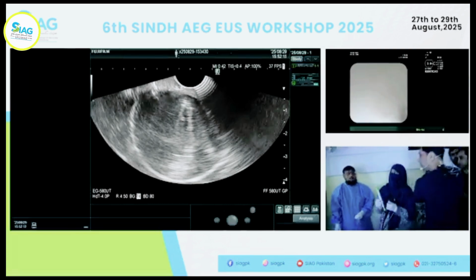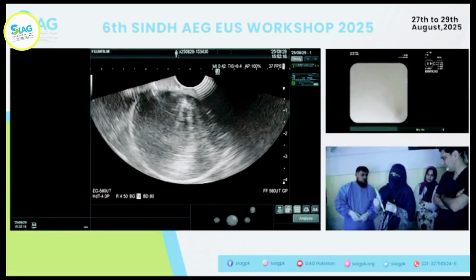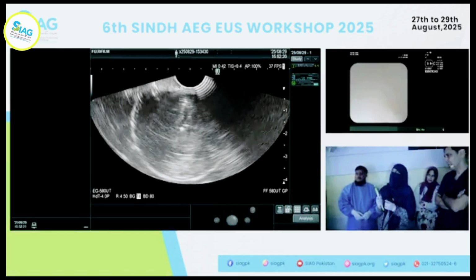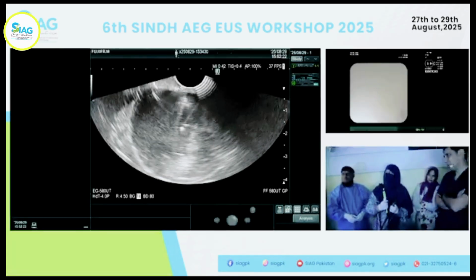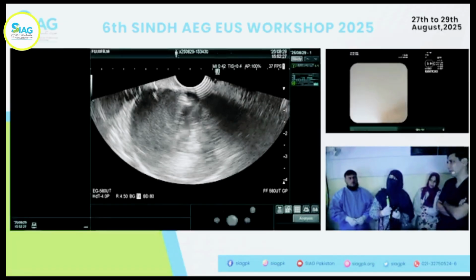So now, Doctor, please remove the lock you have kept. You are not in humans. Now go in. Go and now rotate your shoulder. No, you're fine. The whole needle isn't visible yet, is it? Now you can start seeing it. So this is what I mean. You can actually learn from here.